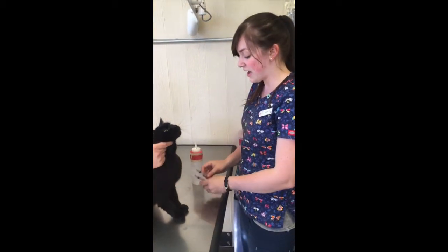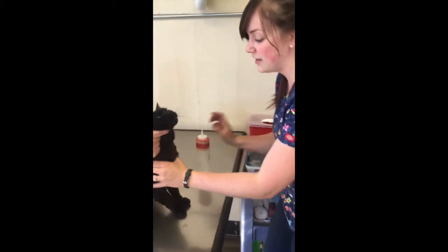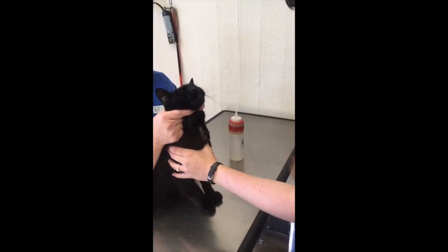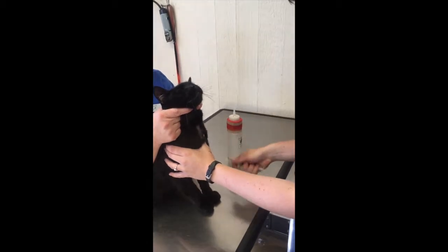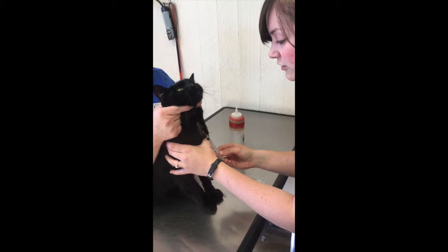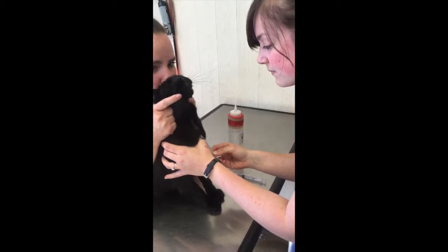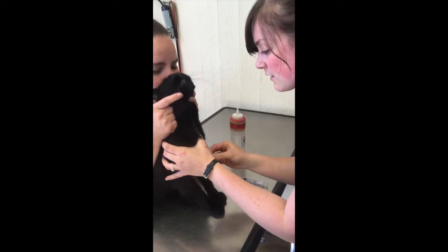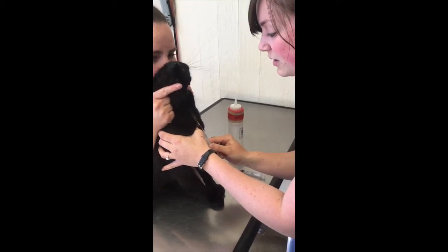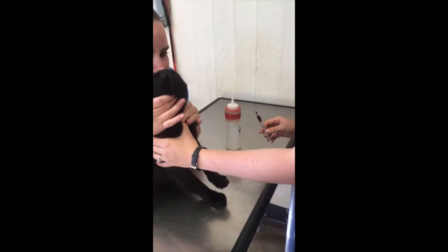Alright, I'm going to be doing a jugular blood draw on a cat. So I have my syringes and needles, and I have some isopropyl alcohol. I'm going to go ahead and hold off in his thoracic inlet to build pressure up in the vein. Put some alcohol in the area. Take the cap off my needle. Make sure bevel side is up. And I'm going to insert my needle. Now that I'm getting blood in my syringe, once I'm done, I'm going to release the pressure off the thoracic inlet, hold off, and remove my needle. And we're done.